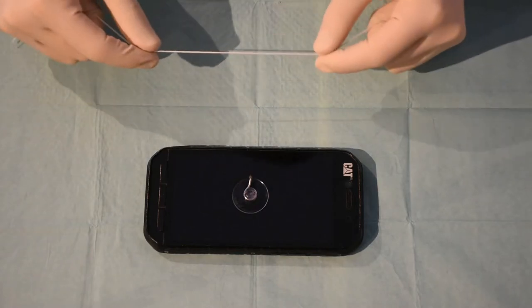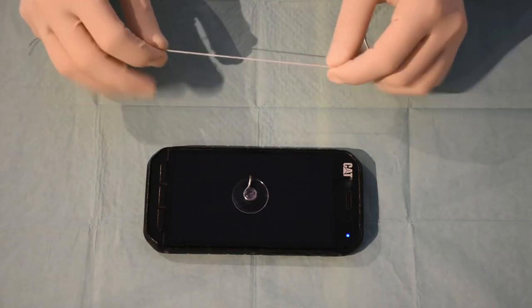For the surgeon's knot there are three techniques. The first one I'm going to show you is a one-handed one.